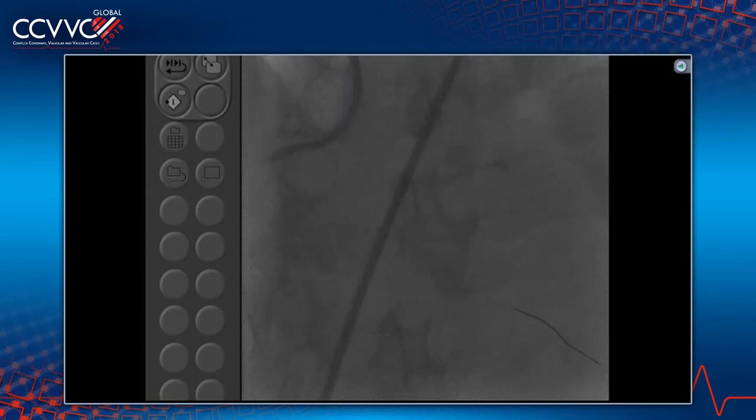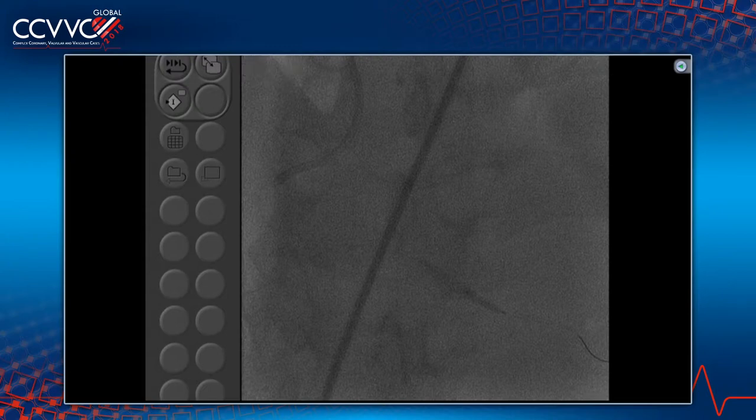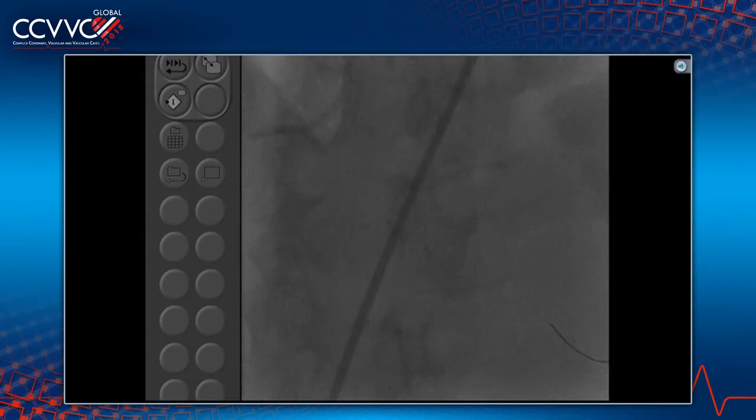Would you consider using IVUS here? I think it's going to probably look fine with a little massage there. I guess not. I was to get the lesion length? No, I mean, for these long CTOs, we like to use IVUS. We should do OCT, so we can use the app a little bit in this case. We don't know the actual vessel size for the long-standing CTO.